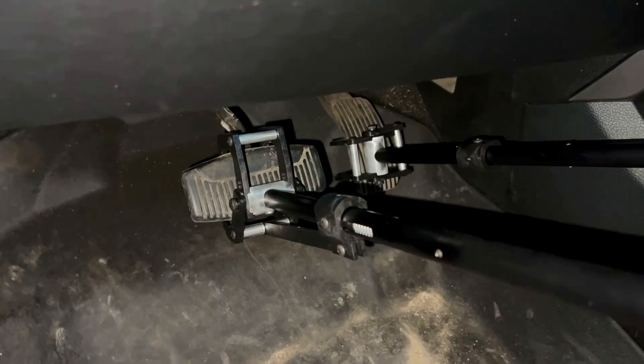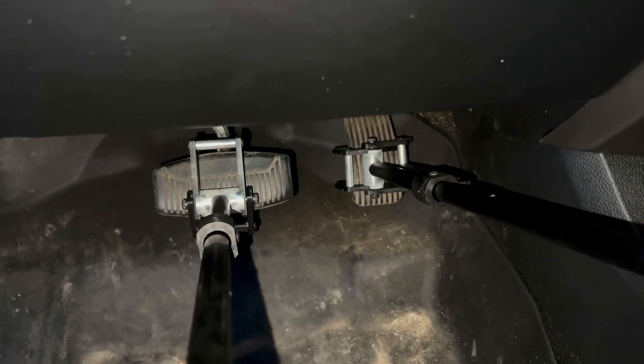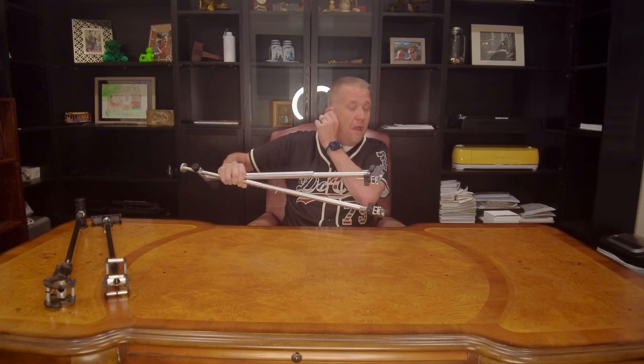There are a couple of big differences you'll notice between these two. The Pedal Master has a trigger that simply opens the clamp at the end and allows you to place it around the pedal, let go, and off you go — but you do have two separate pieces to manage. The Quick Stick has aluminum clamps with large wing nuts that need to be placed around the pedal and clamped down very tightly. Both are considered the top two portable hand control options available.